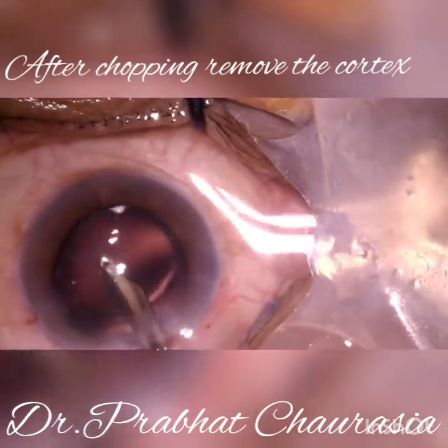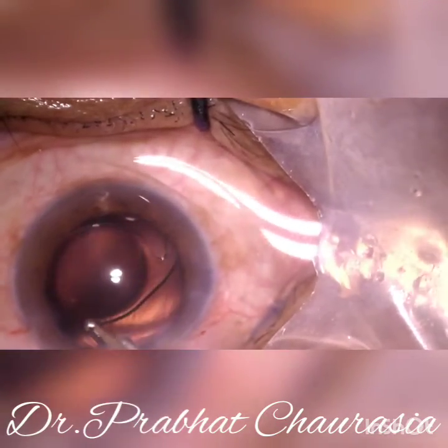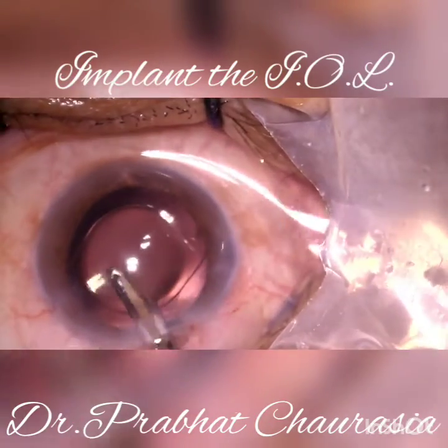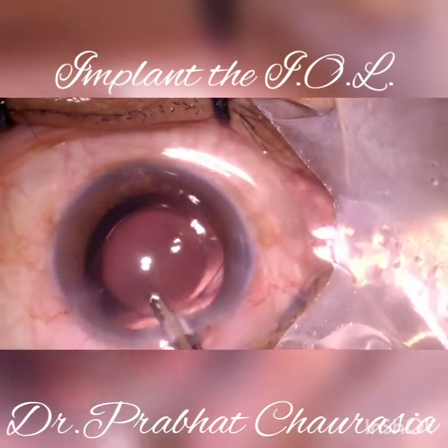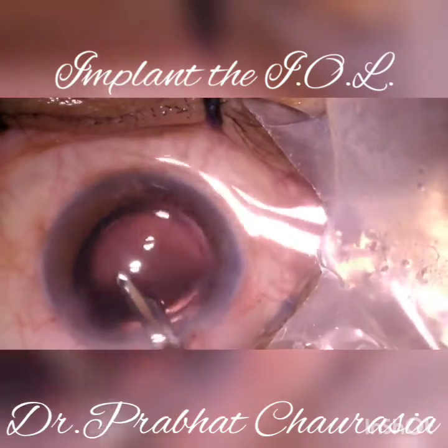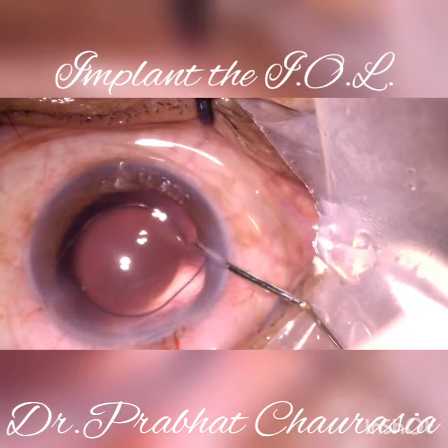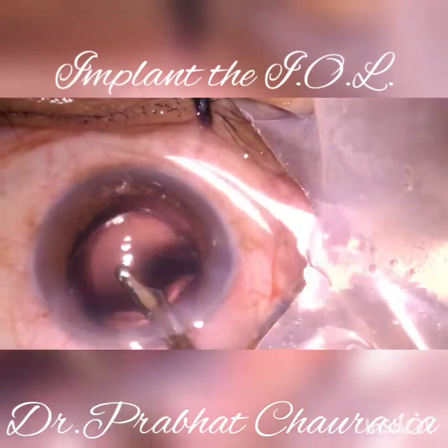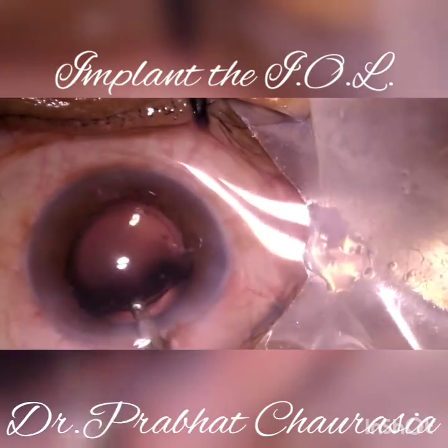After implanting the IOL, remove all the HPMC from the anterior chamber and from the posterior surface of the lens. Do not leave any HPMC inside the anterior chamber. Then inject pilocarpine intracamerally and wash it, followed by preservative-free moxifloxacin, and hydrate the wound.